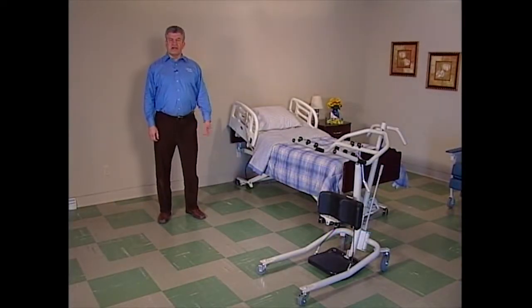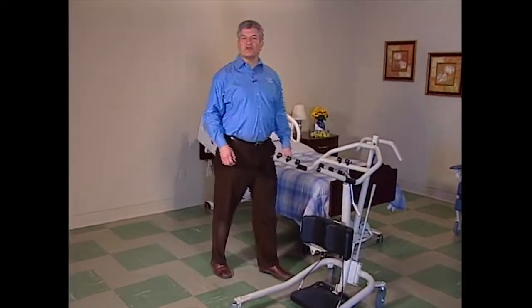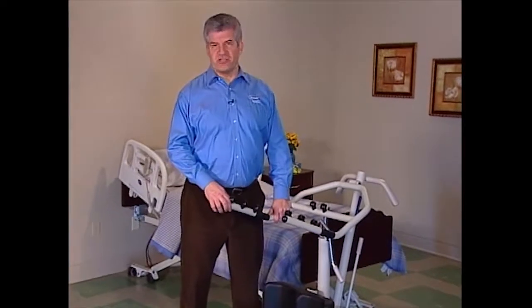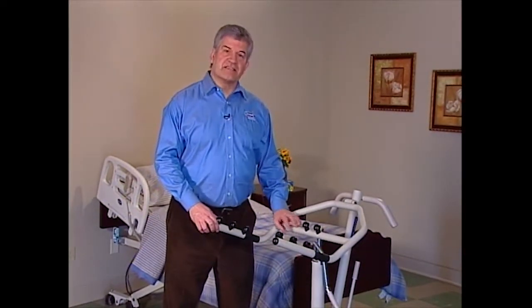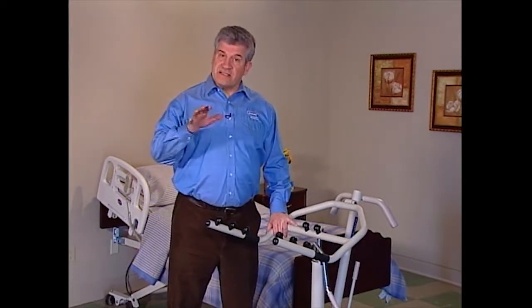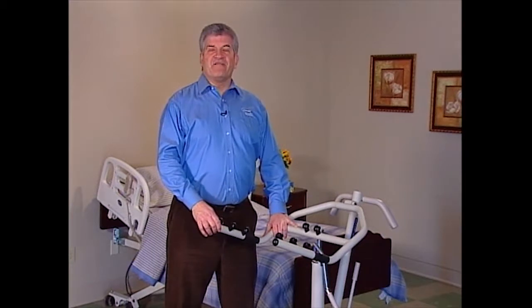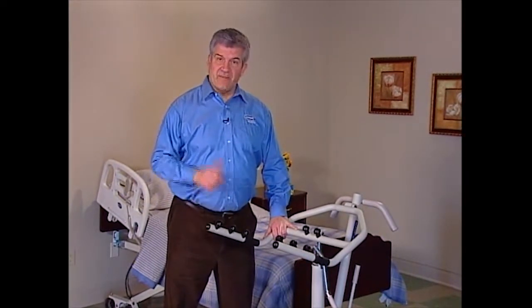The Invacare Get You Up stand-up lift is a valuable tool for transferring partial weight-bearing residents, as well as those that need rehabilitation support. The Get You Up makes it easier to assist most residents from one seated surface to another seated surface. In-care stand-up lifts are made up of three assemblies: the base, the mast, and the boom or lift arms.